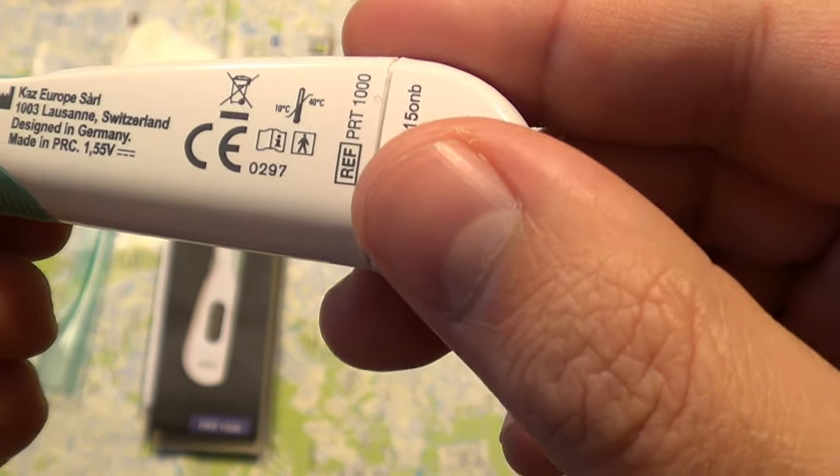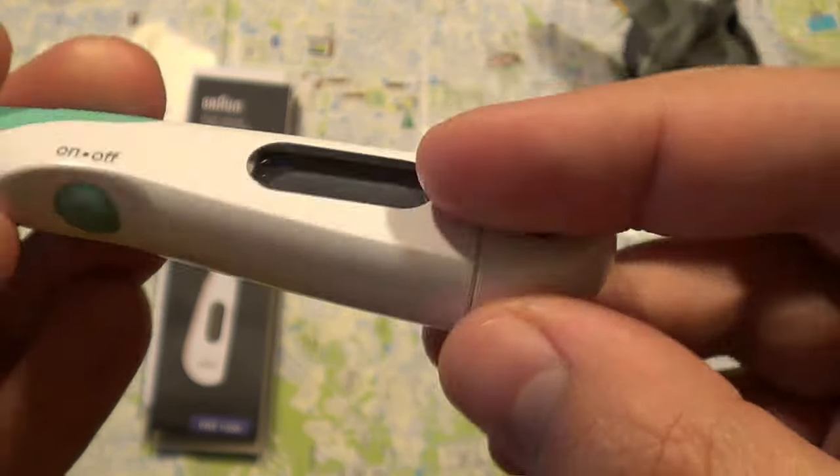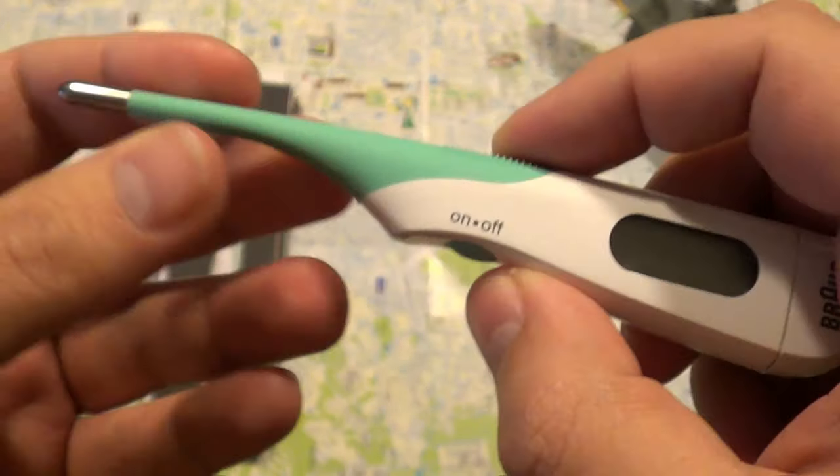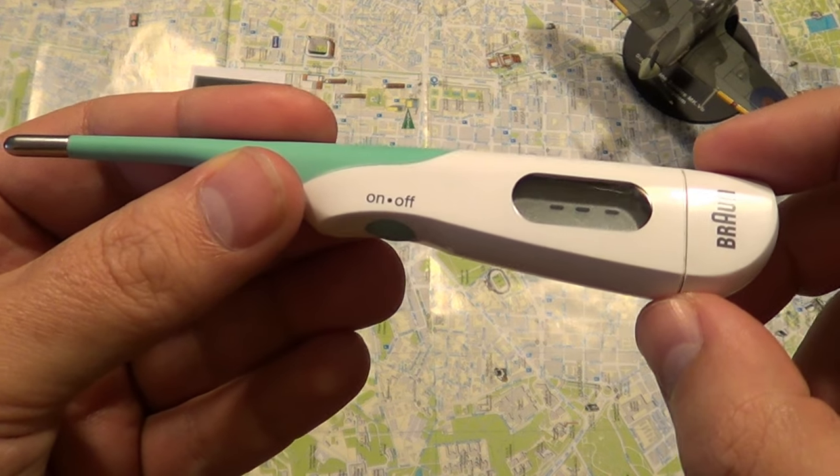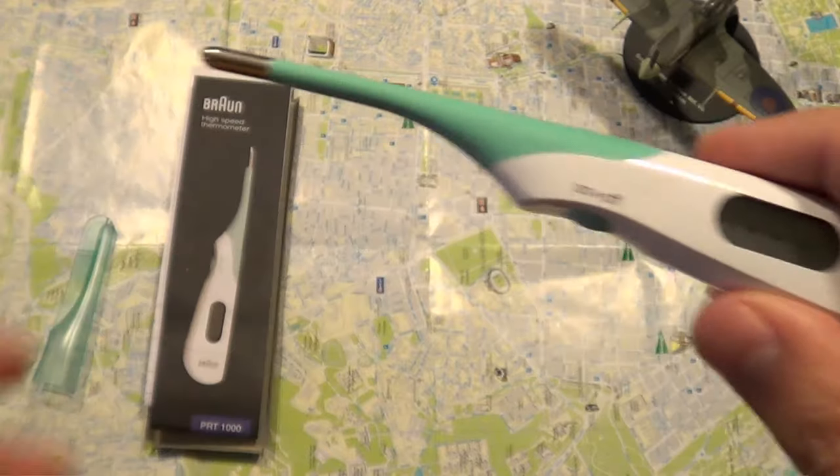It says it's designed in Germany but made in China. It's Braun, it's a good company. So let's push the on/off button. And now we have the three dashes — we can use it.